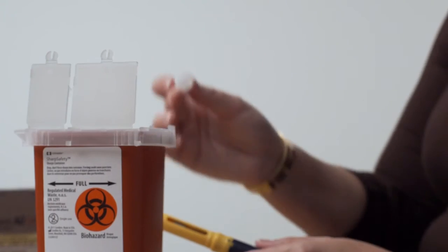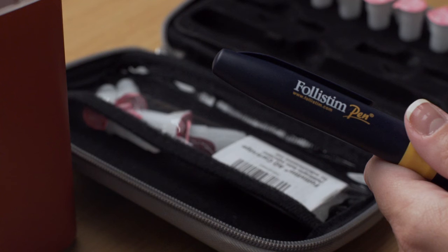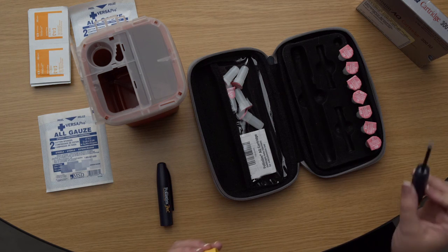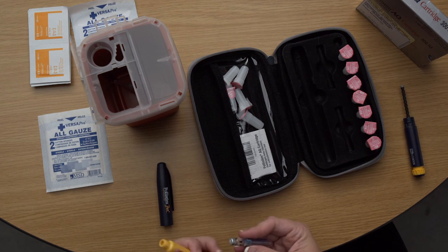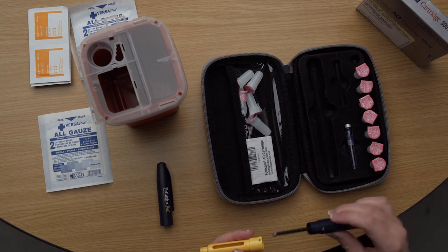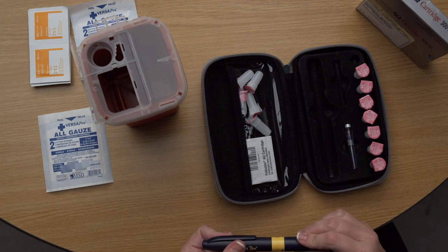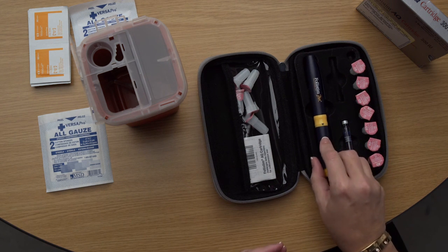Safely dispose of the outer needle shield with the used needle right away. If there is medication remaining in the Follistim AQ cartridge, put the pen cap back on the pen and store it in a safe place. It can be stored at room temperature or in the refrigerator, but be sure to never store the pen with the needle attached to it. If the Follistim AQ cartridge is empty, unscrew the yellow and blue sections and set the blue section aside. Remove the empty Follistim AQ cartridge from the yellow section and safely dispose of it in the same safety container used for needle disposal. Reassemble the pen and store it for your next use.